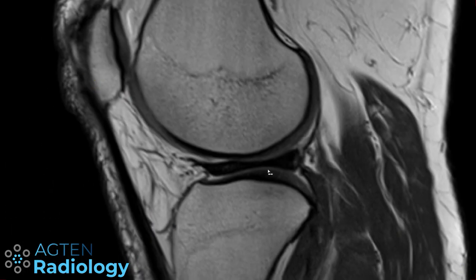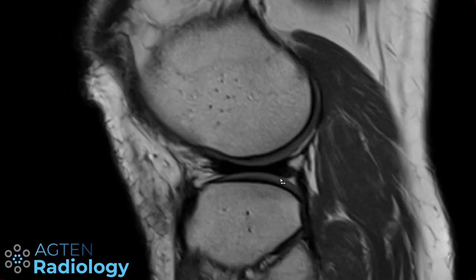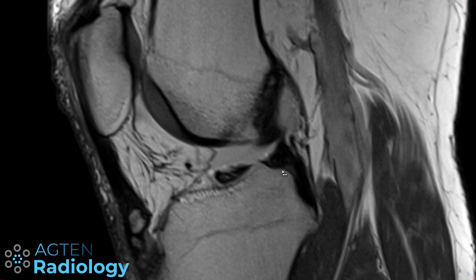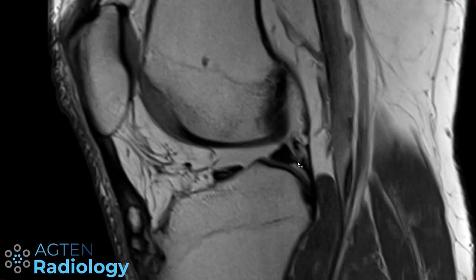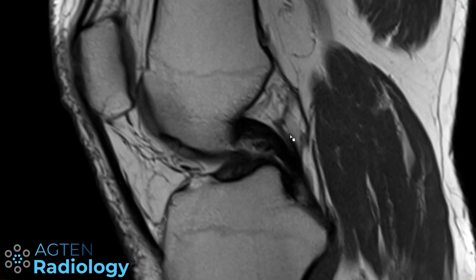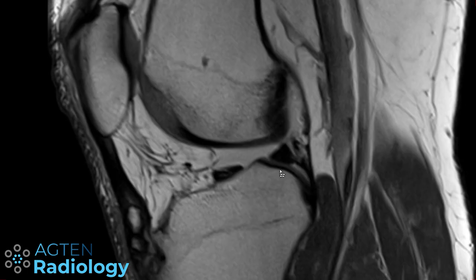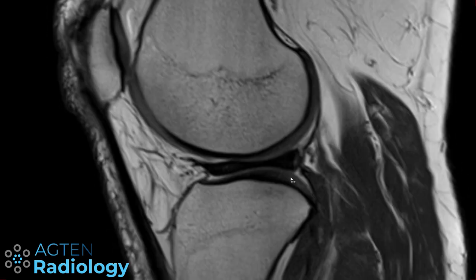And if you noted it, this patient here has a discoid meniscus, and there is another variant that can happen. So if the discoid meniscus is just attached with the Wrisberg ligament and we don't have a posterior root here, then it's a so-called Wrisberg variant of the discoid meniscus.